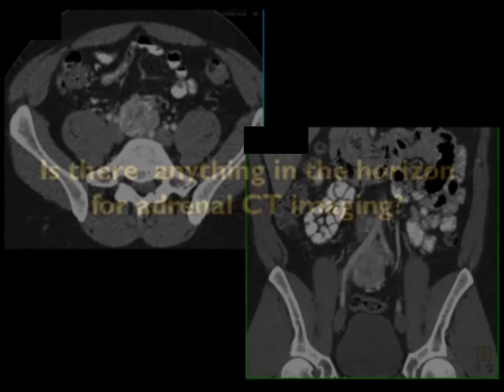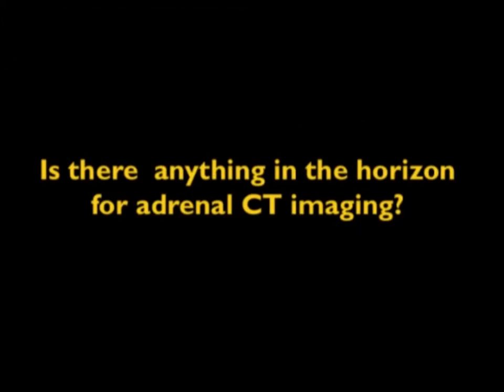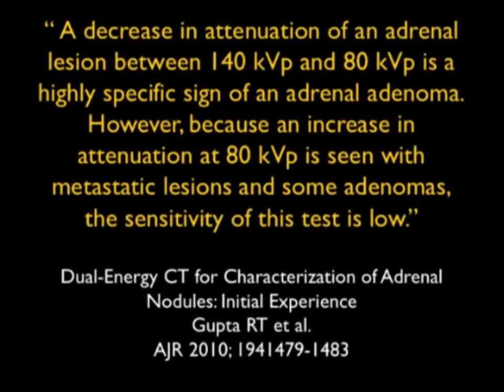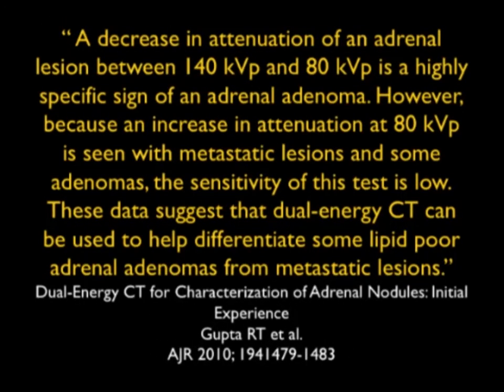Very nicely seen. Now, just to end, is there anything new in the adrenal horizon? We are doing more 3D imaging because with laparoscopic surgery being done for adrenal lesions, 3D mappings are indeed very, very helpful. People have tried using dual energy CT perhaps as a way of diagnosing adenomas. There's some work being done. The results are kind of promising. That's a nice way of saying they're not successful yet. But perhaps with more experience, we'll be able to use dual energy as a way of separating adenomas from non-adenomas.